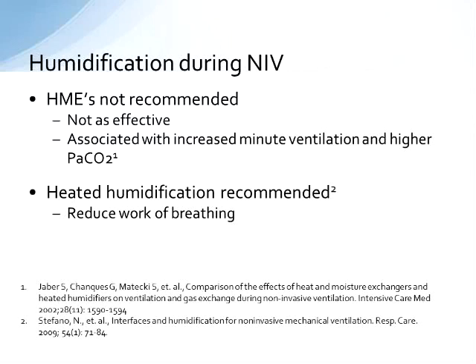So briefly, just a couple of words here about humidification with non-invasive ventilation. Really, HMEs are not recommended, not really thought to be as effective as a heated humidification system. It's really difficult to charge an HME, particularly if you're using a single limb circuit and the patient isn't exhaling back through it.